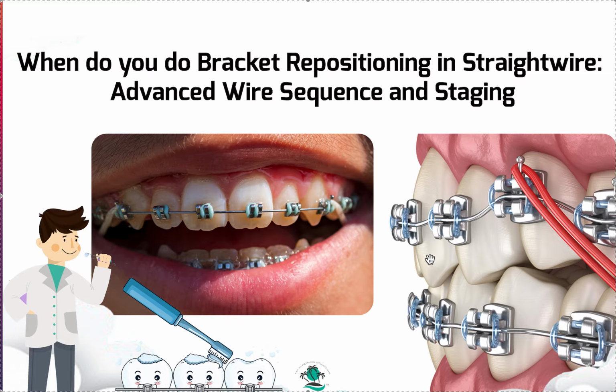If you caught that way back then, some doctors even give the patient something to sign saying, I am happy with my bracket positioning, will not be asking for any future changes. I think that's a little cold, but there's nothing wrong with that. It will honestly nip it, so that they take the time to look at it now and make an opinion now if they don't like something, and I want to know their opinion. I don't want them to be unsatisfied at the end of treatment and feel like they can't say anything, right?